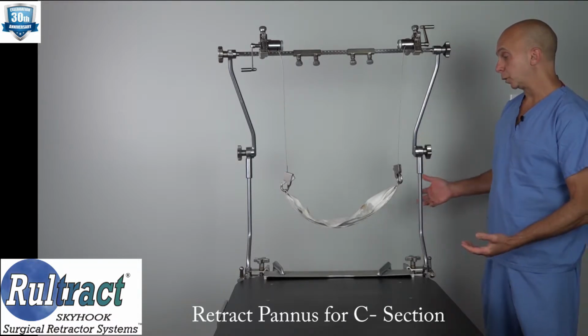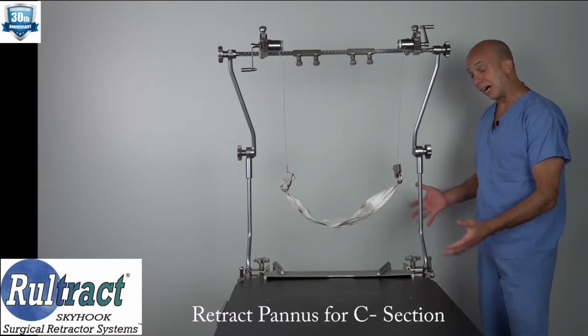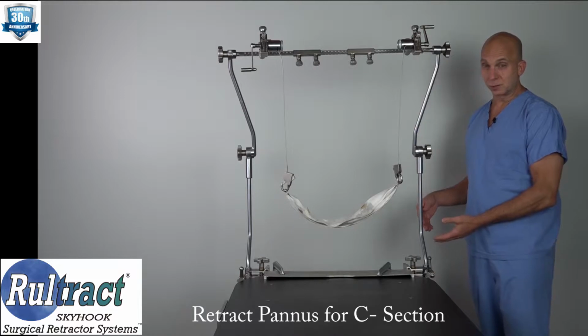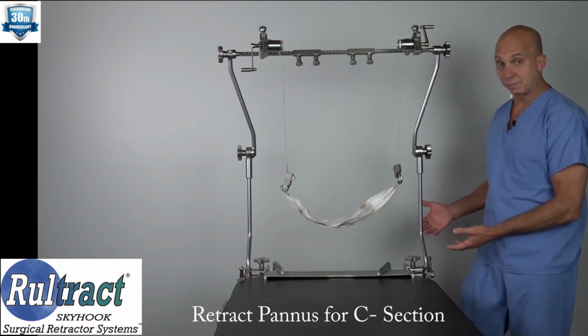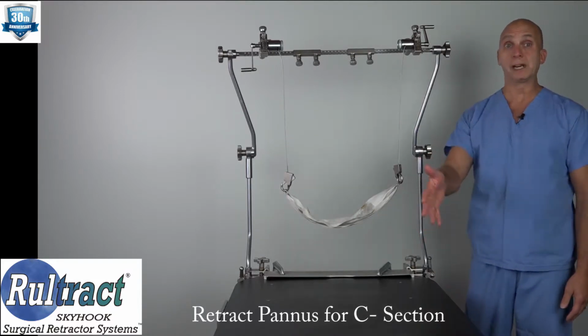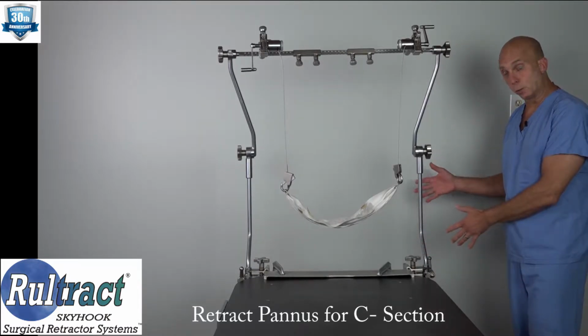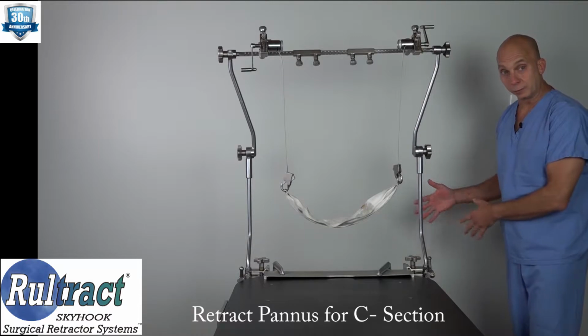First of all, we're going to set the retractor up as high up on the table as we possibly can toward the patient's shoulders or possibly head if possible, in order to keep it out of the way for you. And we have specially designed posts that actually help move the equipment even further out of the way.